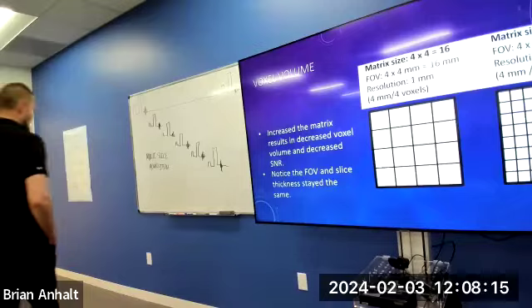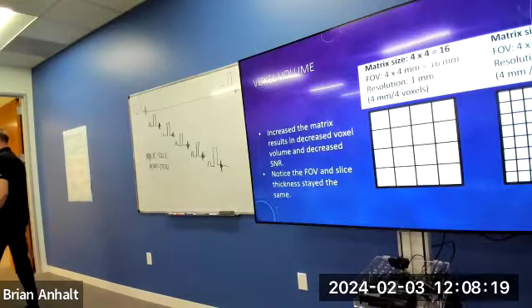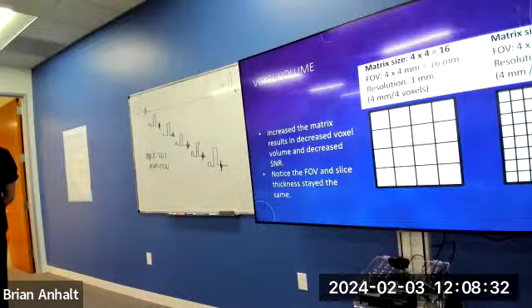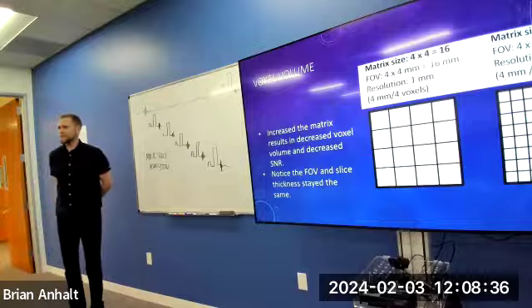All right, and another thing, let's revisit multi-slice acquisition. I know we talked about it in, I think, week 2 or 4. Does anyone remember what that was? It was in the PowerPoint. We went over it, but I didn't test you on it, so maybe some of you have forgotten. Essentially, multi-slice acquisition states that we have to collect one echo per slice in a TR period.